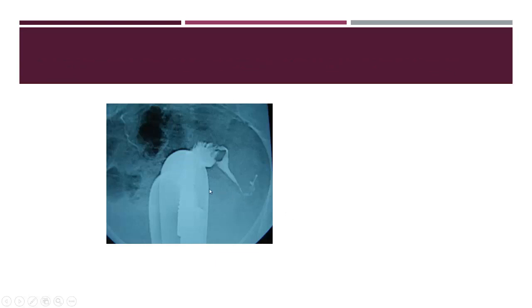What about this case? The uterus is in abnormal position. Here, when we inject the cannula, I found that there is a capacious cervix. Here, the cervix is capacious.